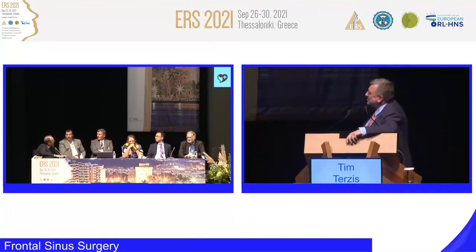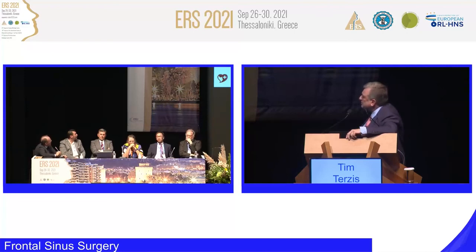That's a lovely case, this, I think. I mean, case 8A looks to have a little bit of osteoneogenesis, so when you want to open it, I think you have to open it. And in this case, maybe a drug-eluting stent would help. I have a series of these, and they are quite good in this case. So once again, it depends on the local situation, but this is an option you should keep in mind.